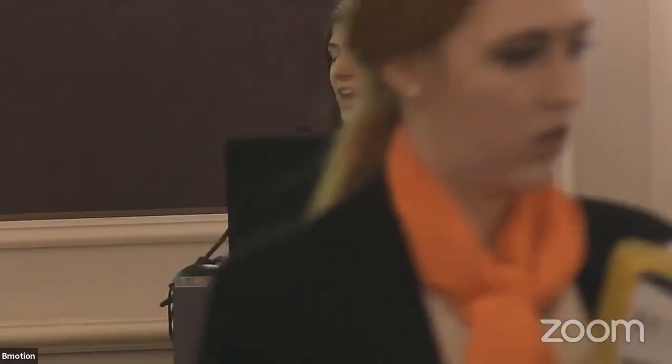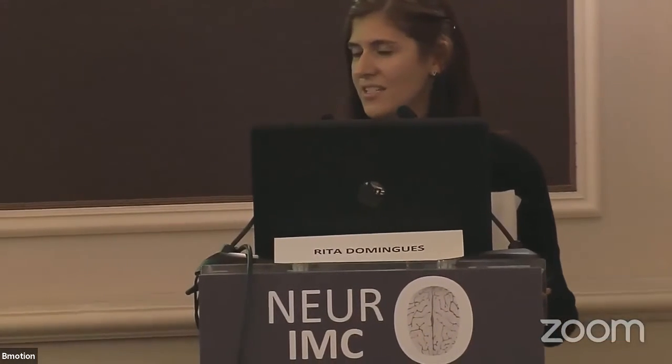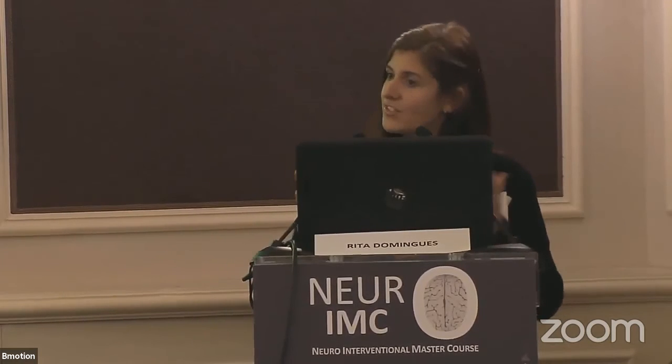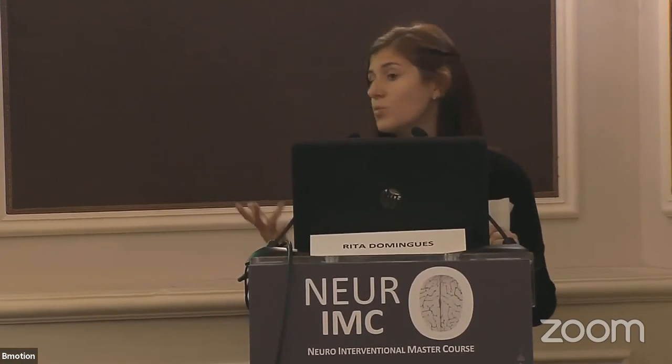Do you think that TPA modifies the composition? Yeah, we have been doing some preliminary testing on that, and now we are conducting a beta test inside, with the silicone models, in which we expose the clot to a certain concentration of TPA and see the results, then try to remove it and see if there is any difference. We don't have the results yet, but we believe that it has an impact. If it's for good or for bad, I am not sure.